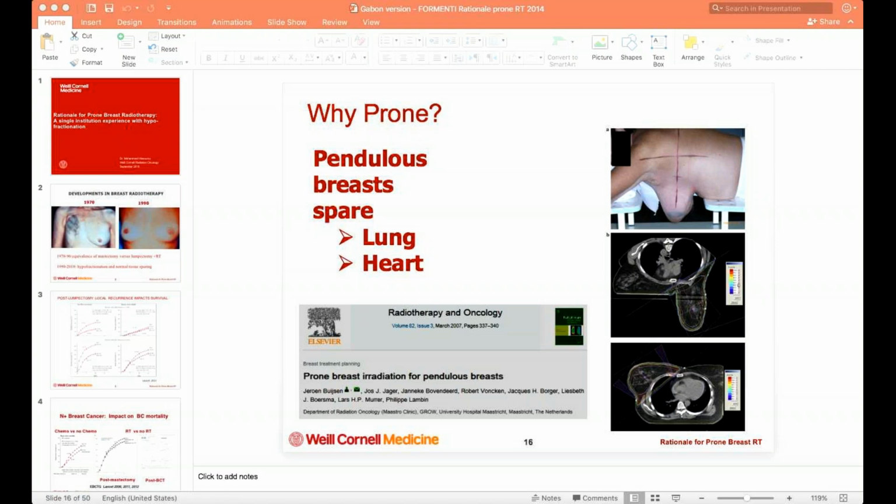And then you can look up each pacemaker. Many of the companies have reports or guidelines about the maximum dose that can go to that pacemaker. So working with your physicist, you can usually try and create a plan to ensure that you limit the dose to the pacemaker. And then another strategy is to move the pacemaker. I'm not sure how feasible that is in the different settings, but those are strategies that I've found you can employ.